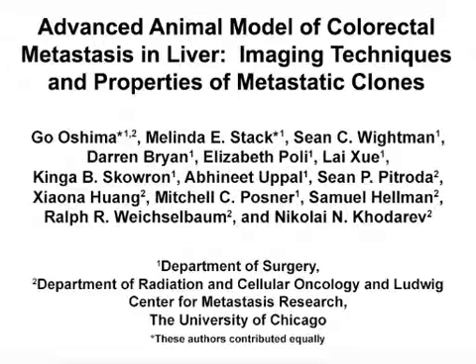The overall goal of this approach is to model liver colonization by metastatic tumor clones generated by colorectal cancers, and to use this model to improve diagnostics and therapy of liver metastases. Clinical observations indicate heterogeneity of metastatic disease. Our model provides an ability to capture this heterogeneity, to detect genes which are associated with oligometastatic and polymetastatic disease, and to use this knowledge for improvement of early detection and treatment of metastasis.